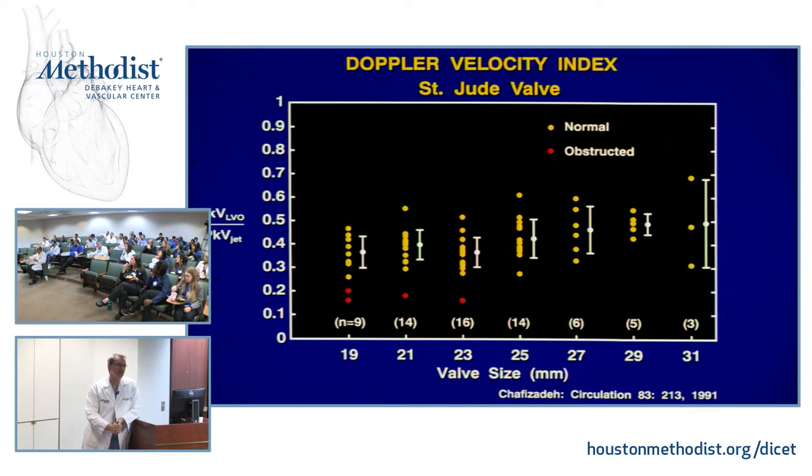So I think you need TAVR valves. Well, first question is, what's normal? Everybody's got a little step up. So if I measured yours or mine, we shouldn't be greater than 1.0. We're probably around 0.8 on a normal. We don't bother doing it on normal, but you can. So normal's somewhere around 0.8, I would say, plus or minus a little bit.